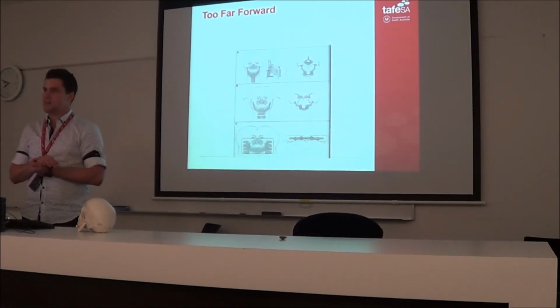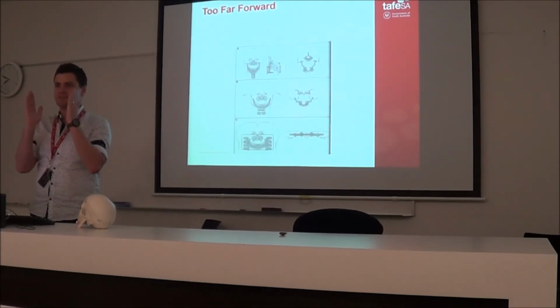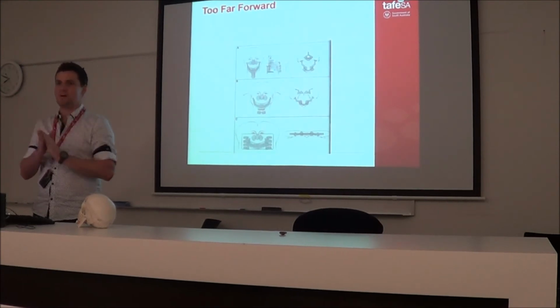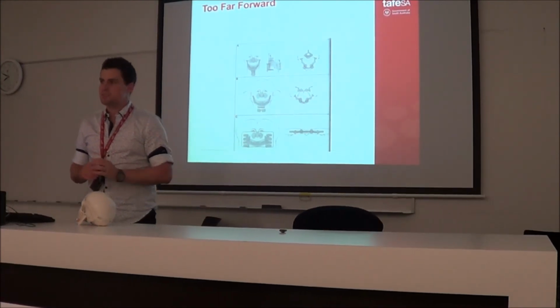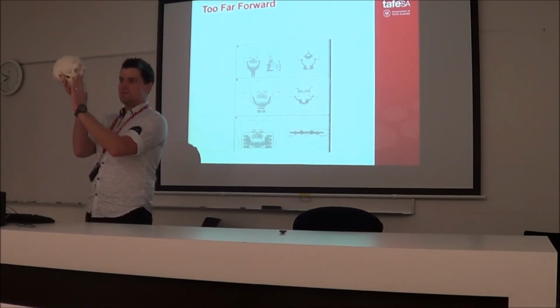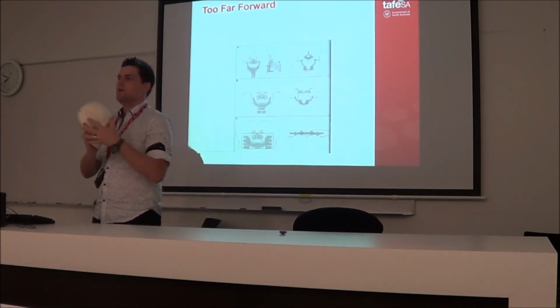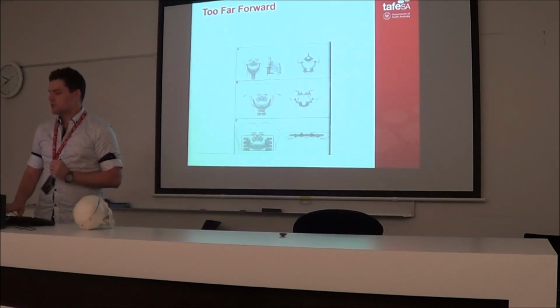Now, what did we say if we reduce the object film distance? What do teeth do? Do they get skinnier and smaller, or do they get bigger and wider? Smaller. So when you're too close to the sensor, that means if we're meant to have a nice red line lining up between the 2 and the 3, we're now moving this head forward, and we're going to get everything being a bit smaller. So let's have a look at the 3 hallmarks.